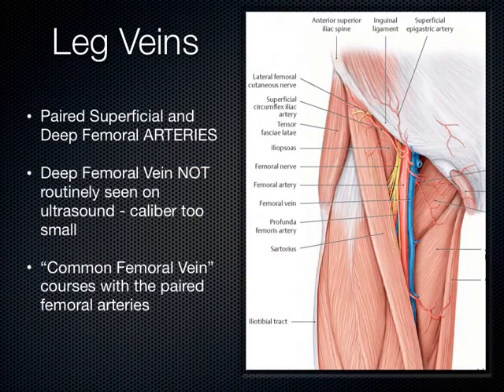So in terms of the leg veins, I know you haven't had this anatomy yet, but this was the only time we could get in to do this lecture. Essentially, you've got the inguinal area up there, sometimes called the inguinal canal, right along here. This is the inguinal ligament that's going along here, okay? You can see some muscle bellies here. But this orientation of the femoral nerve, and then the femoral artery, and then the femoral vein is seen medially to it.